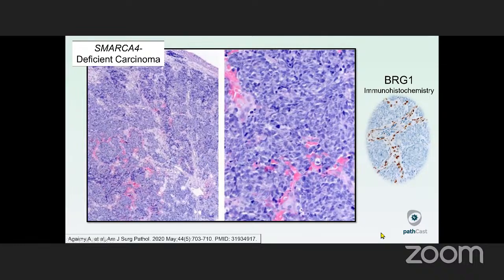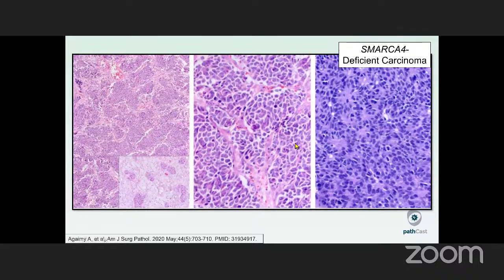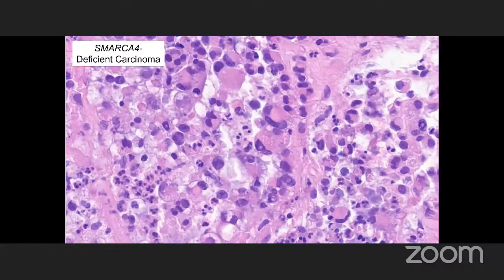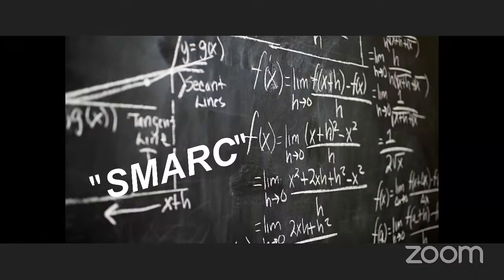And if it looks like a neuroendocrine carcinoma, but it doesn't really pan out with your immunos and other features, be very careful and think about applying BRG1 immunohistochemistry, which is the protein for that gene. Here's another few examples. Sometimes they can have rosettes and have this nested but kind of neuroendocrine look to them. The other feature that they sometimes adorn is these really ugly rhabdoid cells. And here's an example of one that's just sheets of these rhabdoid cells with very high-grade nuclei. Occasionally they'll be almost all those type of cells in the sinonasal tract. So that's a clue also. I think if you see any of these features, the smartest thing you can do is make sure you include INI1 and BRG1 in your immunostaining panel.